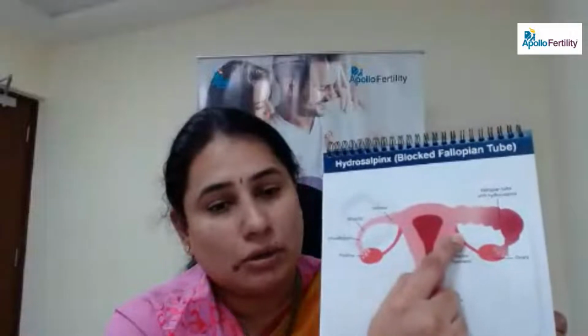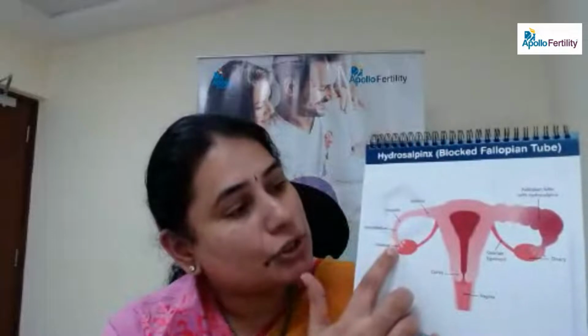Now coming to hysteroscopy, the cavity of the uterus plays a very important role, and the endometrium plays a very important role in the implantation of the pregnancy. So these are all the endometriotic spots. And as I told, the dilatation of the tube, the hydrosalpinx, which I was talking about, when we do laparoscopy for this, where it is dilated, you can see the normal size of the tube.